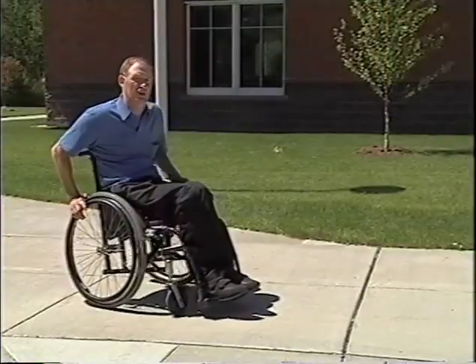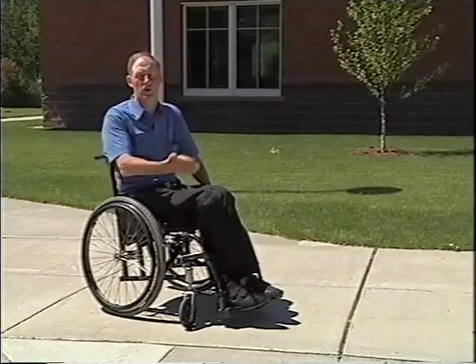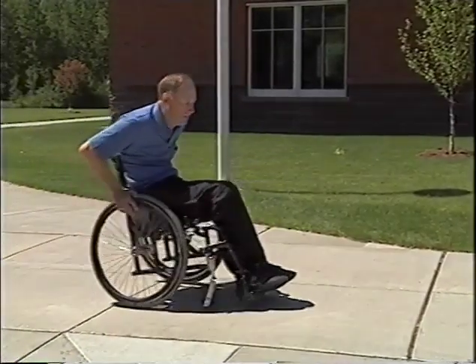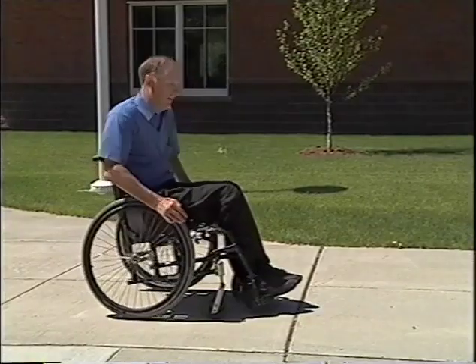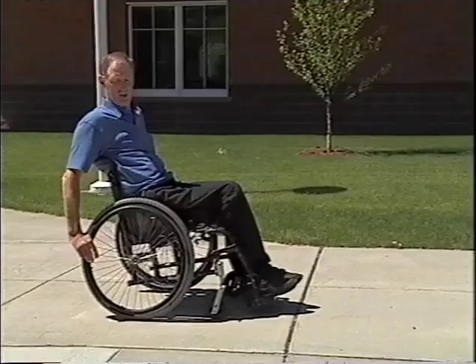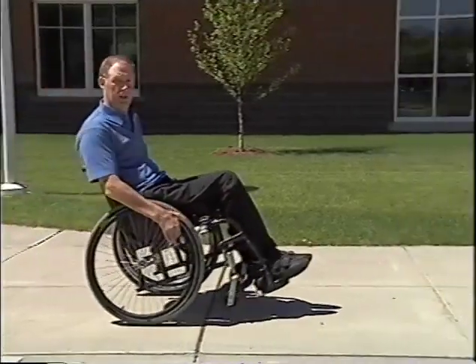And the next thing you want to teach after you teach the wheelies is wheeling along and jumping over cracks in the sidewalk just to get the timing down of when to pull a wheelie. Generally what I teach is when you can see the crack between your toes, then reach way back, I call this a giant stride, putting all the weight behind the axle and then lifting the wheels up and going over the curb.